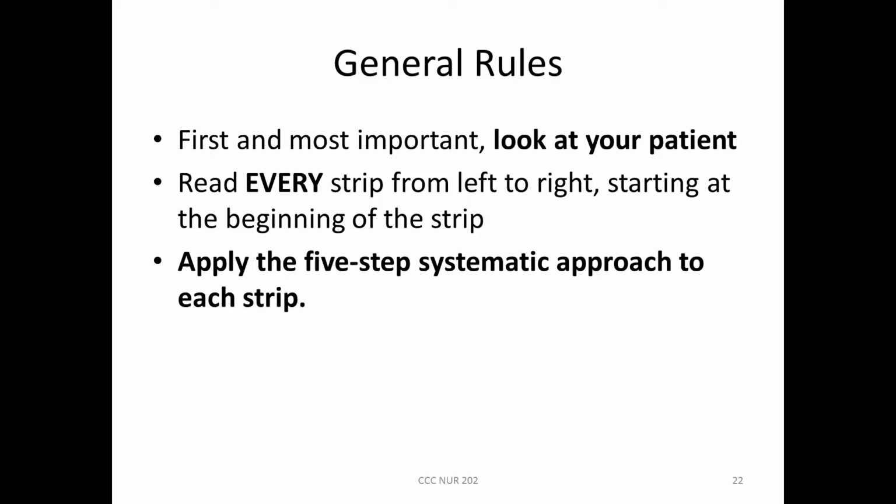But you would never go to a lab slip and look at it and start calling the doctor before you even see your patient, because your patient may look a whole different way from that lab value. Same thing with this. If you have a strip and to you it looks awful and you don't look at your patient, then it's a poor evaluation, and you should not ever treat that.